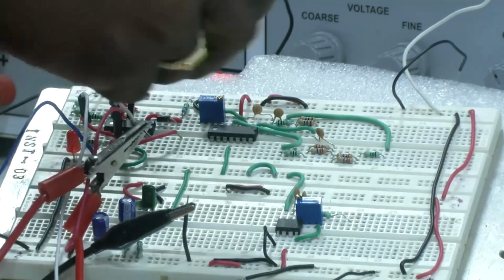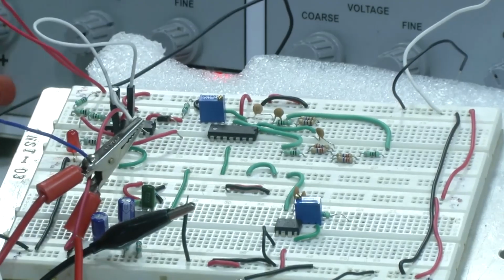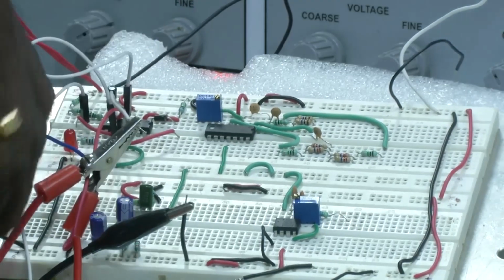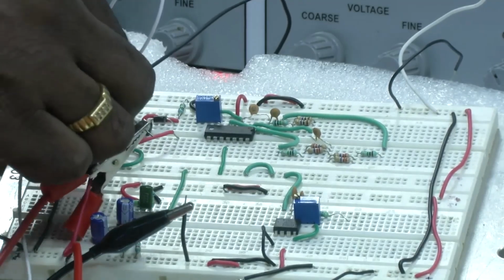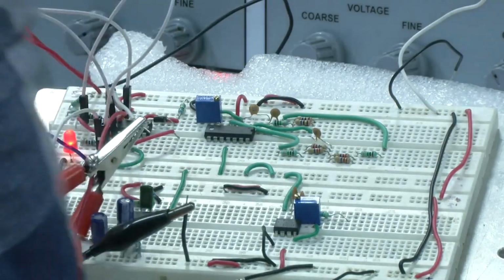So, this is our threshold, right. To this threshold point, I am taking one more wire, I am connecting it to this point. Now, I have to measure the output. So, this is my output. Let me auto set it.